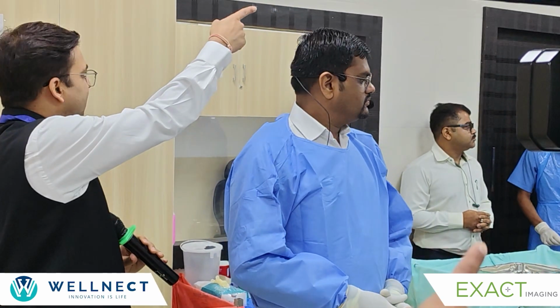Yes. Most urology departments, like in AIIMS, when I started in 2002, we purchased a machine in the department because radiologists are very busy. They don't have time, so we started doing our own ultrasound. My experience also goes like that. In one day we have not become that mature. So from the postgraduate level, I think this should be included in the curriculum. That is my suggestion. Yeah, absolutely fine, sir.